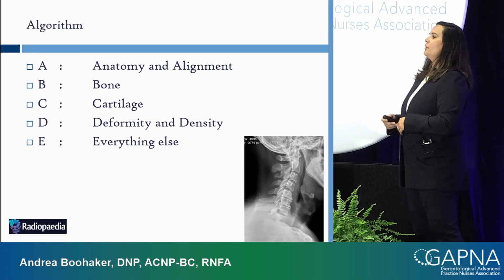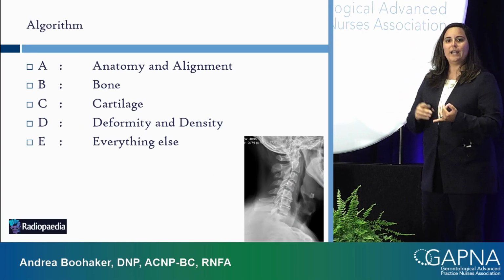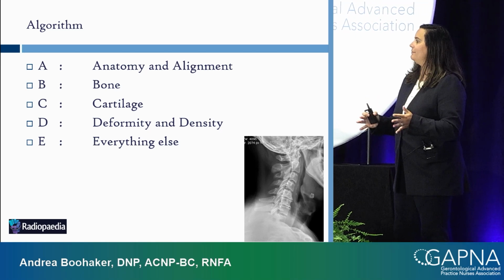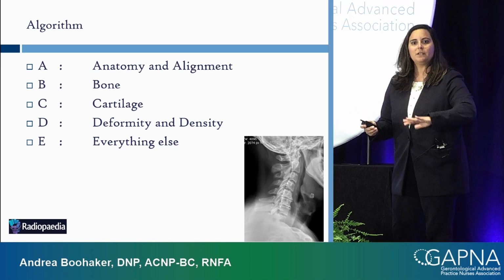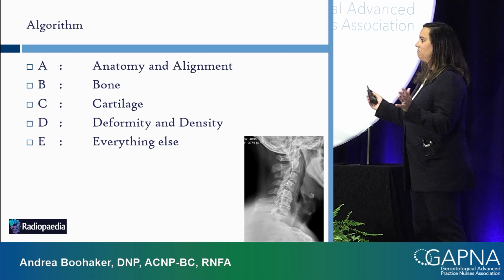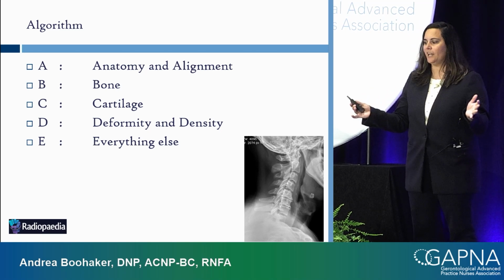All right, here's your algorithm. This is on radiopedia.org. It's an excellent, excellent website, just in case you want something to take home with you to refer back to. A, B, C, D, E. All right? So let's start from the beginning.